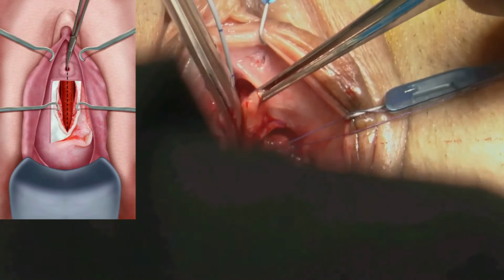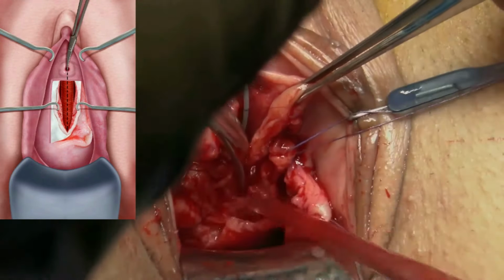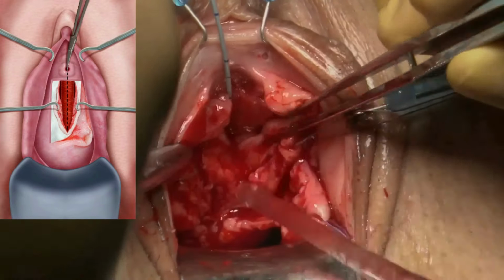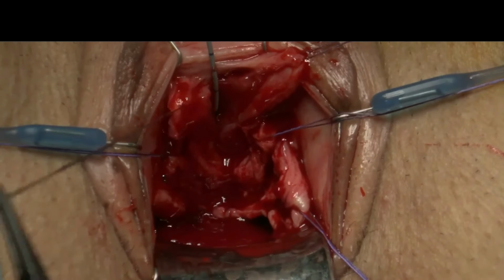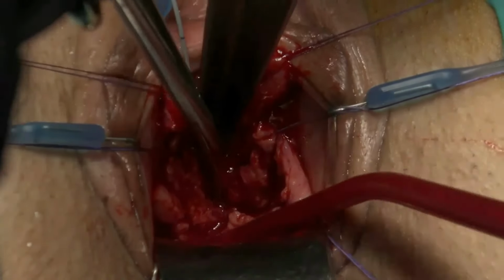A ventral urethrotomy is made starting from the urethral meatus until the healthy urethra. Stay stitches for the urethral meatus. The gorget helps us to reach the healthy urethra.